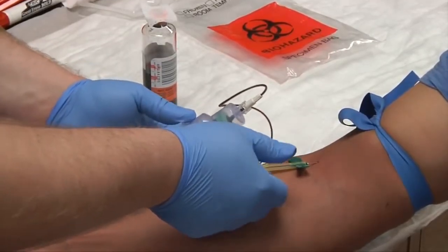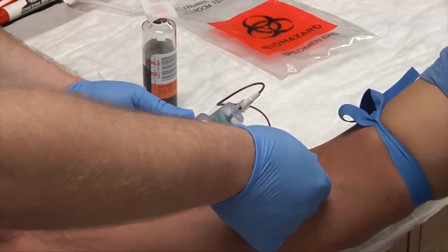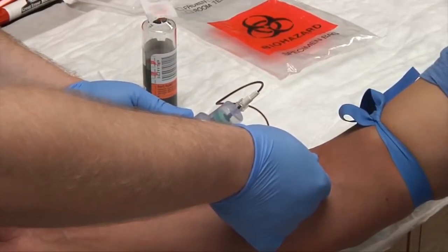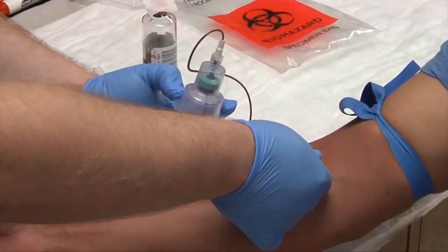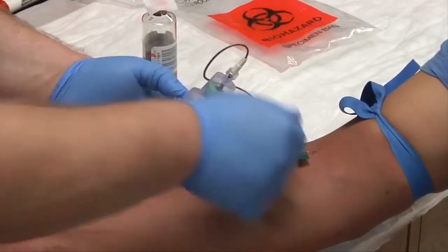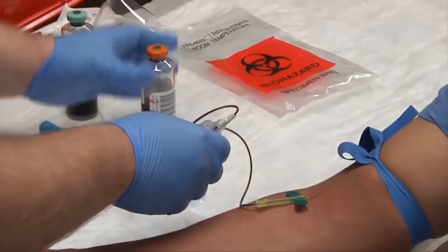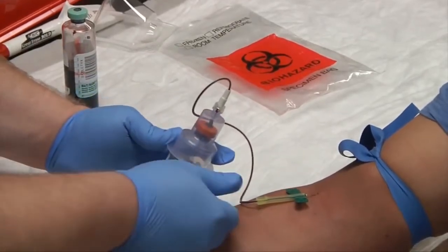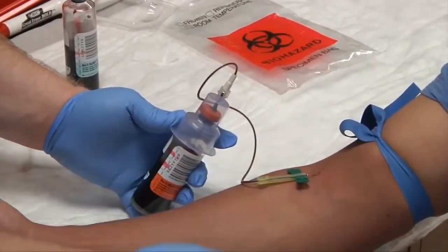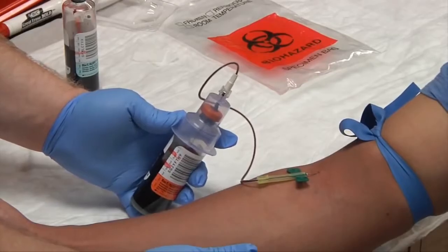Be sure to watch for your fill line. Okay, looks like we have our 10 milliliters in this one. Disengage, set to the side. Grab our anaerobic, insert. Normally you'll hold on to your butterfly, but it's typically best to let it sit freely since we're drawing so much blood.